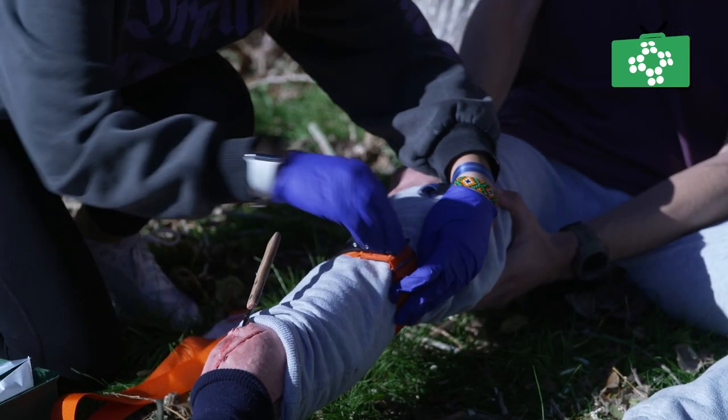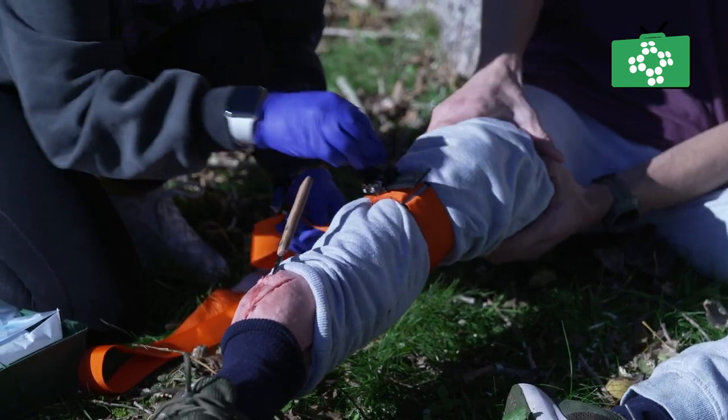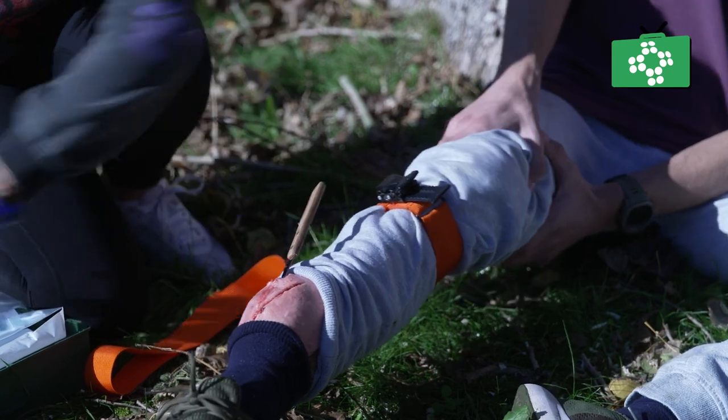With the Rapid Stop tourniquet, you place it around the limb and pull it tight, but rather than using a windlass, you simply tighten it by rocking the ratchet on the front.